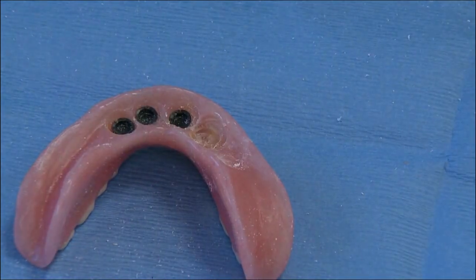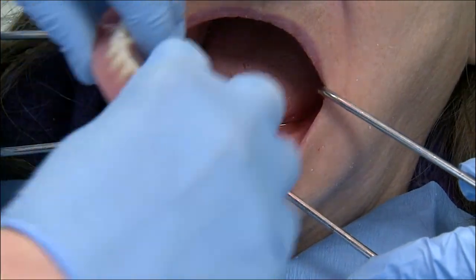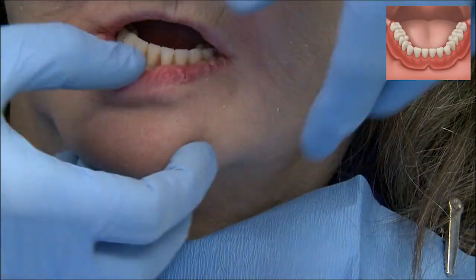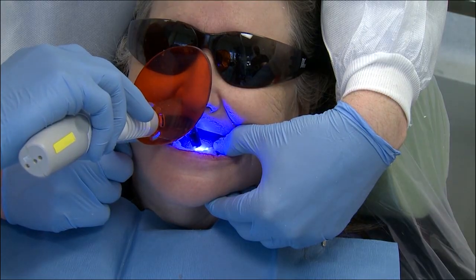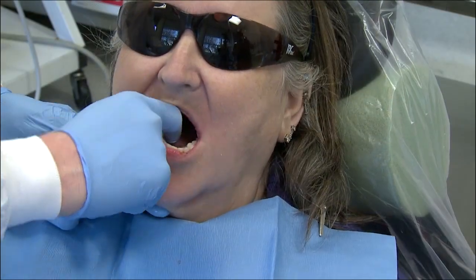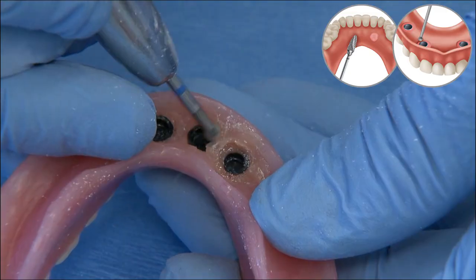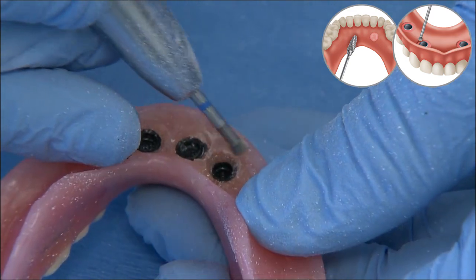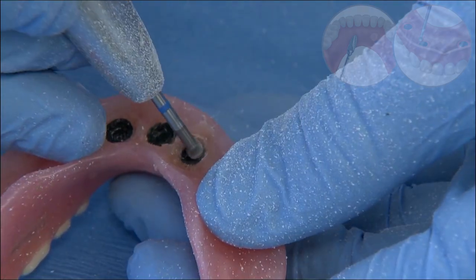Not shown here is that I used the undercut burr and vent hole burr to prepare and finalize the recess on the left-hand side. I've injected chairside attachment processing material two-thirds of the way full on that recess, and I'm very carefully seating the denture onto the edentulous ridge, activating the other three locator denture caps, carefully holding the denture in place in a passive orientation. I accelerate the set of the chairside attachment processing material with a light cure, and in about two minutes I remove that again. After completely set, I remove the denture carefully, inspecting that I've successfully picked up that one attachment. Using the grind burr at high speed, I remove some of the excess chairside material around that locator denture cap — you'll notice how easily the material flakes off. The burr makes short order of any excess material, cleaning it up easily.